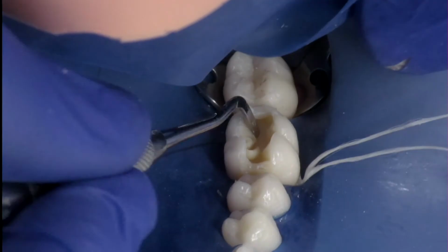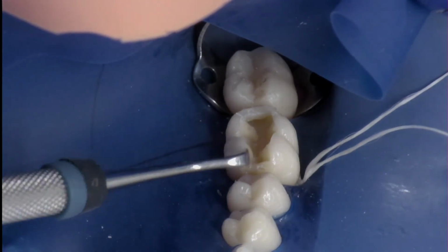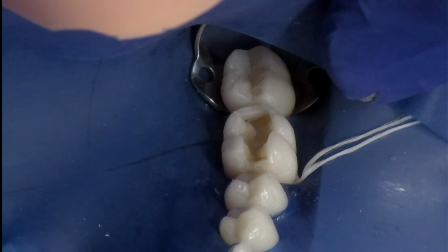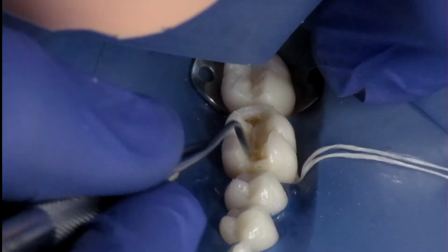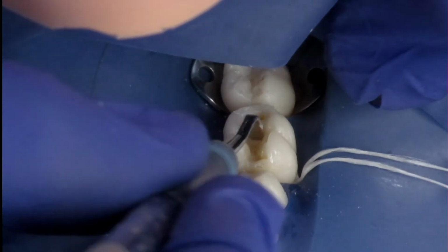Here again, I try to bring it flush with the cavosurface, and that wasn't my goal starting this preparation or this filling. Here I think I'm going to get tired of that large increment, and realize it's not exactly what I want to do. I'm going to tear it out again and try it again.